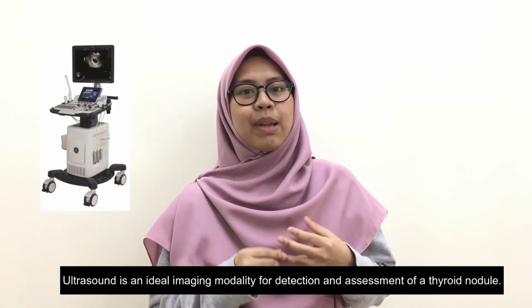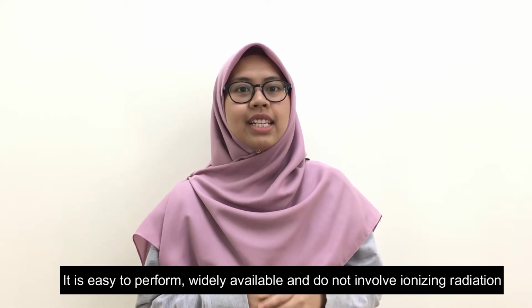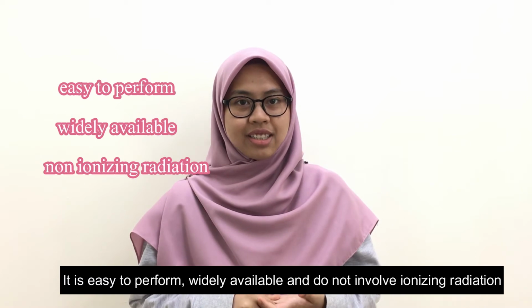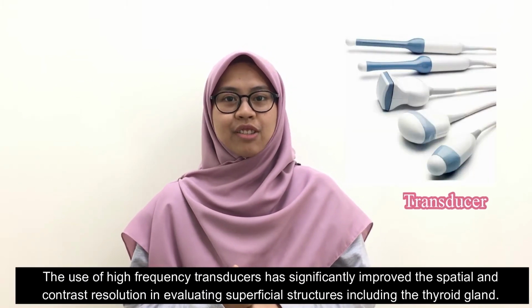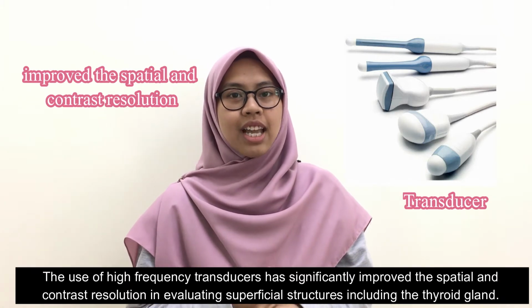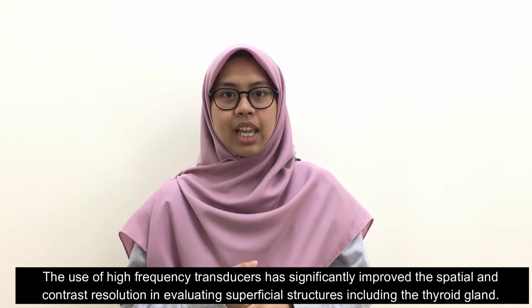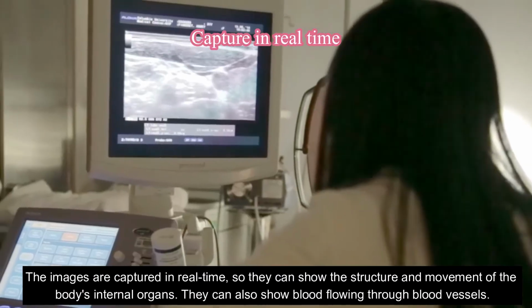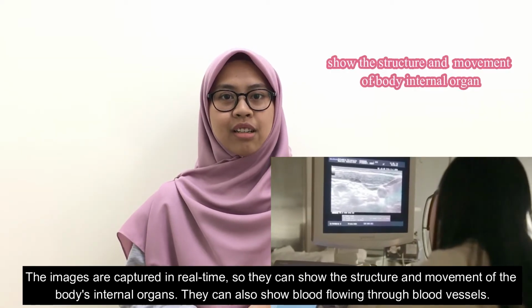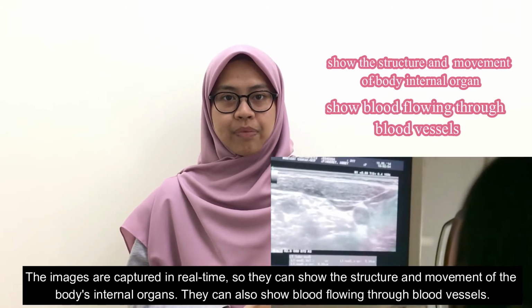Ultrasound is an ideal imaging modality for detection and assessment of thyroid nodules. It is easy to perform, widely available, and does not involve ionizing radiation. The use of a high-frequency transducer has significantly improved the spatial and contrast resolutions in evaluating superficial structures, including the thyroid gland. The images are captured in real time, so they can show the structure and movement of the body's internal organs. They can also show blood flowing through the blood vessels.